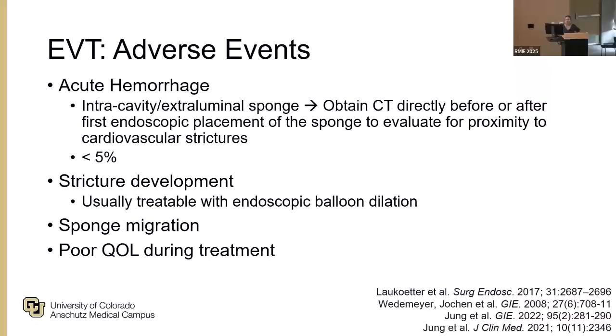It is recommended that if you are putting a sponge into a cavity outside of the esophageal lumen, to obtain a CT directly before or after that first placement of that sponge, just to make sure that it is not adjacent to any major cardiovascular structures.